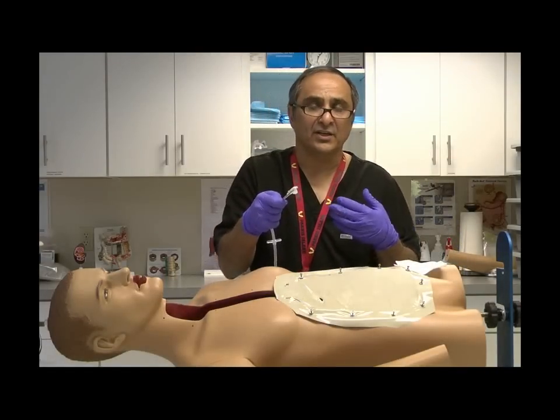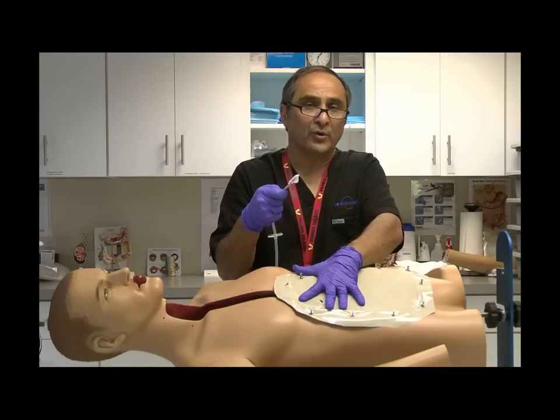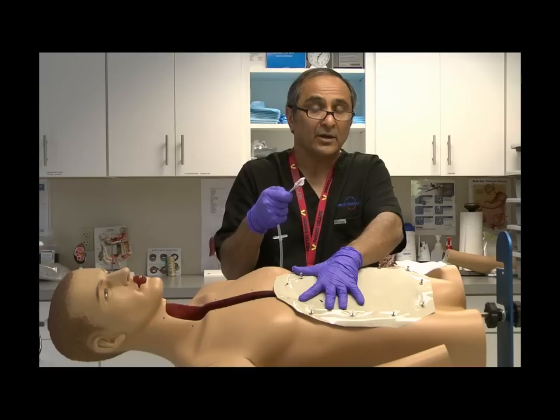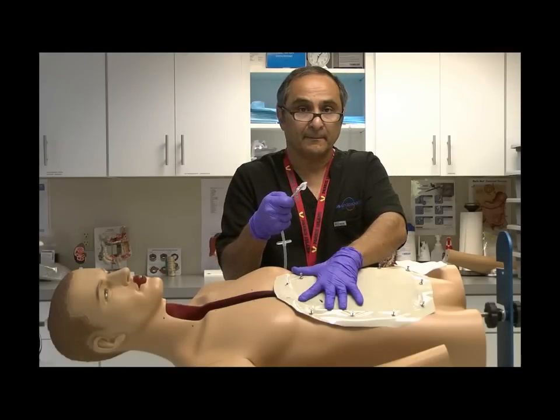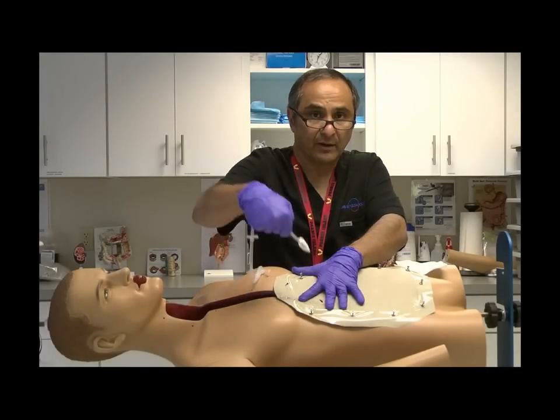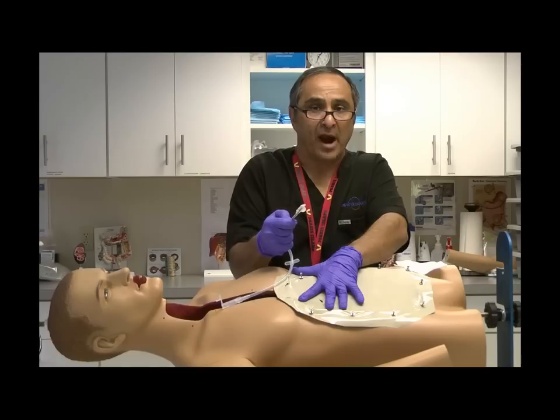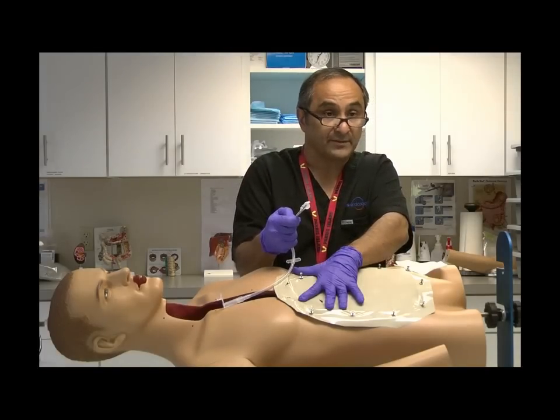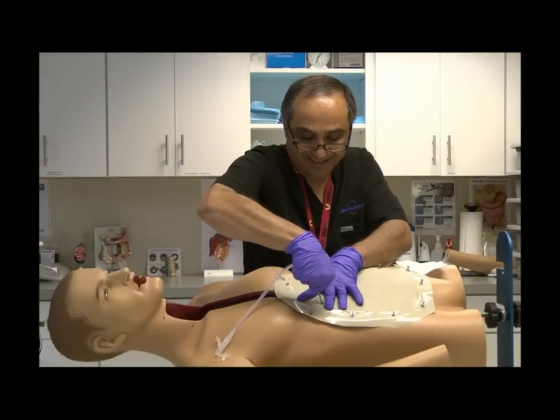When I removed the initial placement device, you saw me place 2 fingers here, or my fingers like so, in order to stabilize the tissue. I'm going to go ahead and do that again during the placement of the non-balloon device. Remember, we made a mental note of the angle of insertion from right to left. That insertion angle is critical to proper, safe, and comfortable placement of the device. So here we go. You're going to see me push it in.